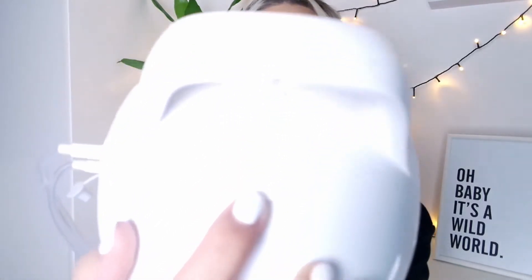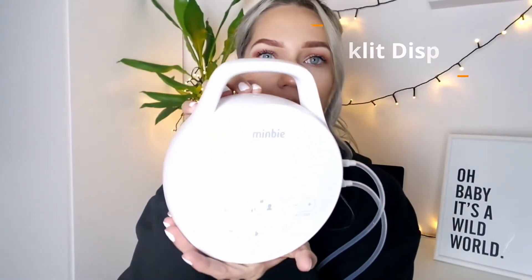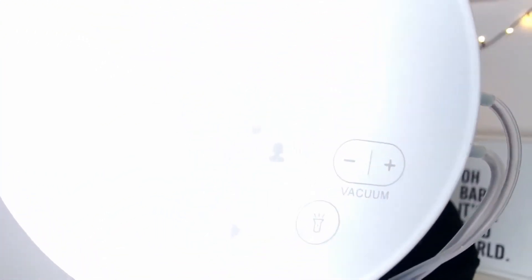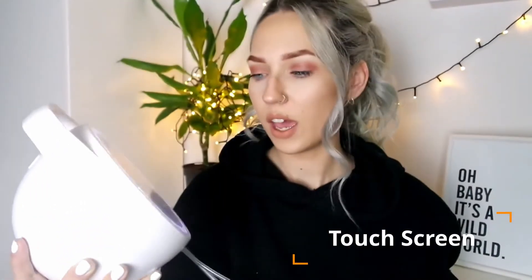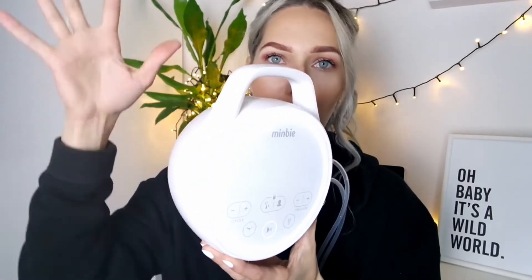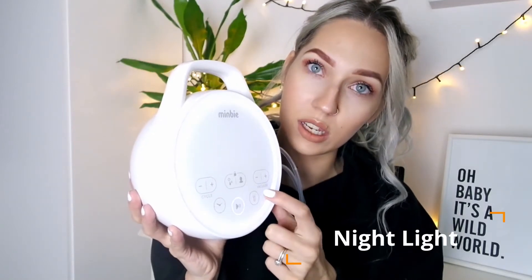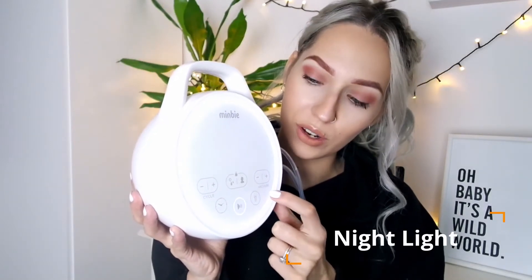The power button is at the top here and once you press that it lights up. There is a touch screen display — none of these are actual physical buttons, it's all just touch screen, which I love. There is also a night light that you can turn on with different brightness settings, which is very good for night feeds.